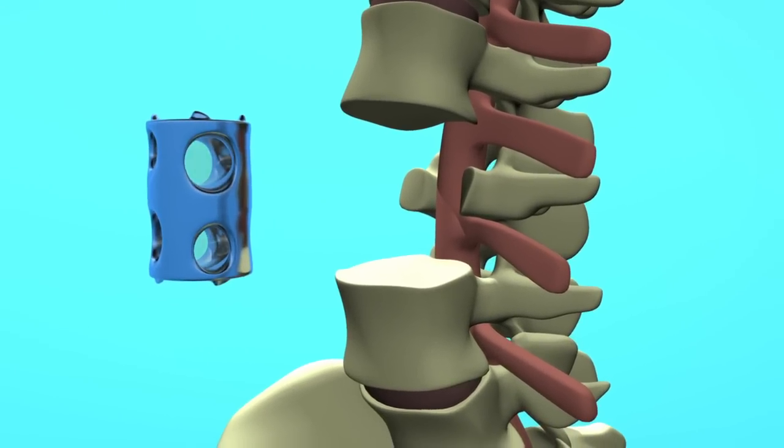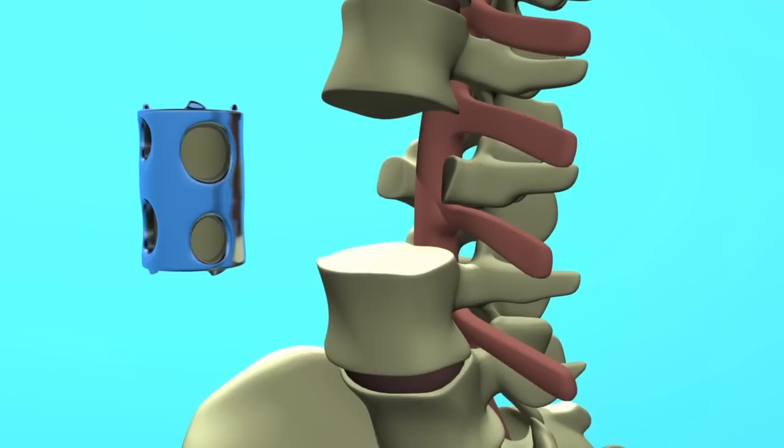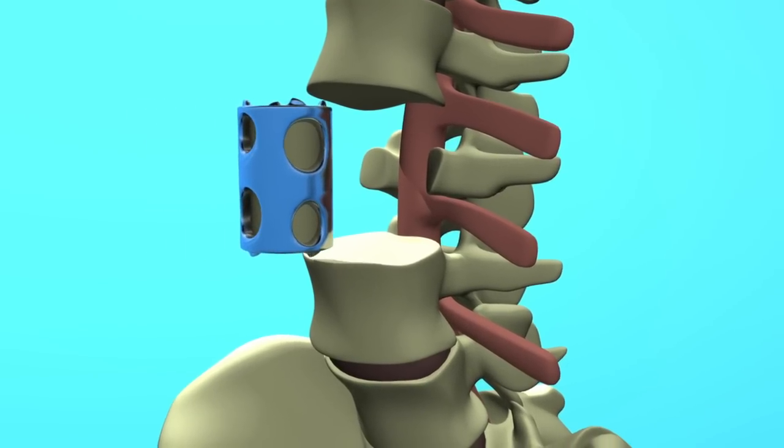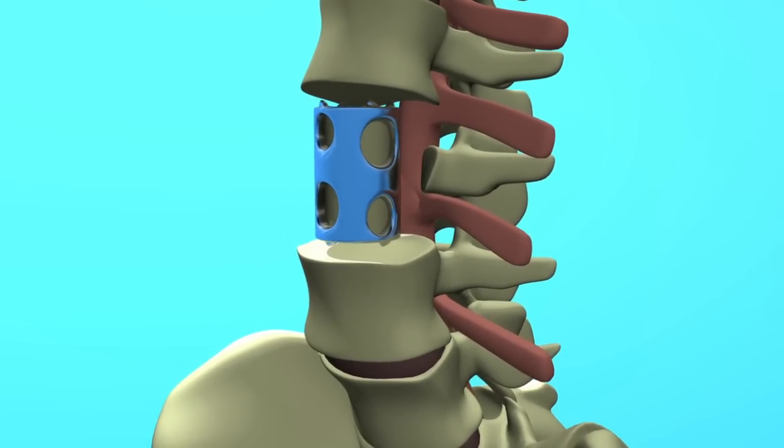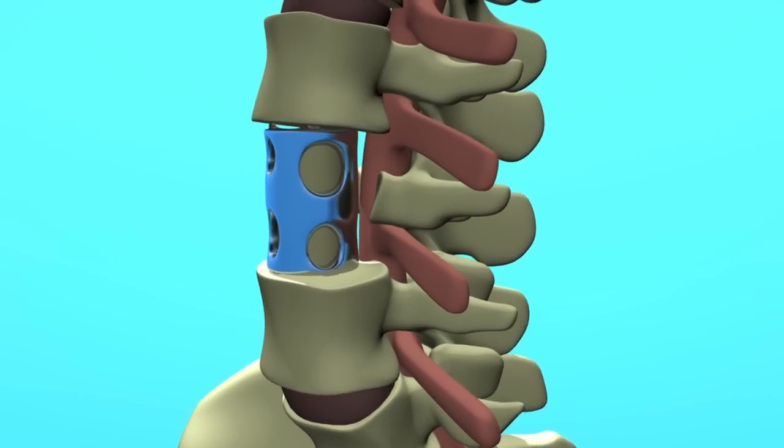Bone graft material is then inserted into the vertebral body replacement, or the VBR. The VBR is then fitted in between the two remaining healthy vertebrae.